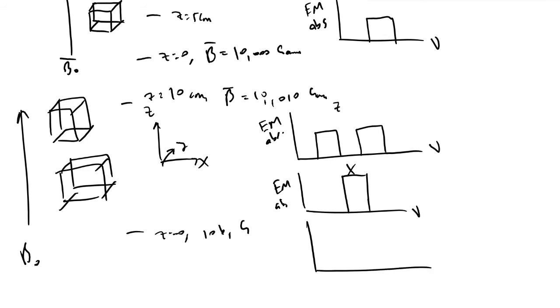And in the y dimension, we will have the same case where we have a lot of absorption along a particular range of frequencies.